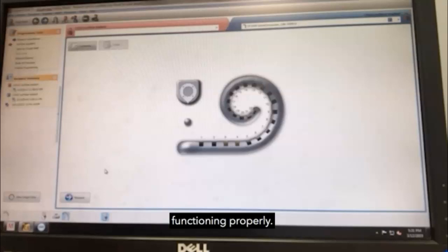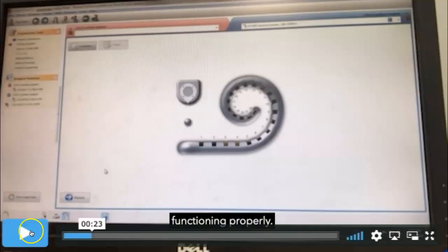And so this is done in the operating room because it's not always the case that all 22, 23, 19, however many electrodes are going to function properly. And if that's the case, then they'll make modifications to how they stimulate. But that's a more advanced topic. But she's going to show you how they test that.